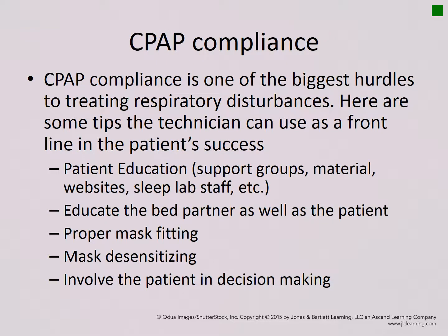CPAP compliance is one of the biggest hurdles to treating respiratory disturbances. Here are some tips the technician can use as a front line in the patient's success. Provide patient education, not only before starting a titration, before starting a sleep study or before your patient leaves, but also offer them some support groups, materials, websites, and the sleep lab and staff as a resource when they need questions answered or want some help.